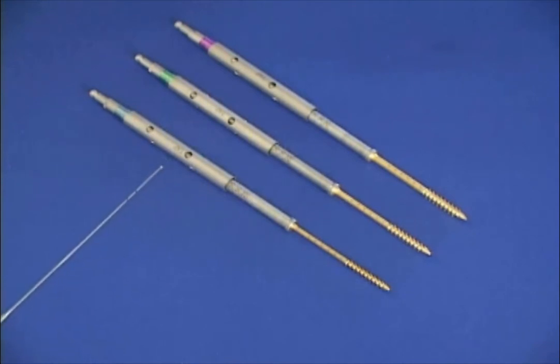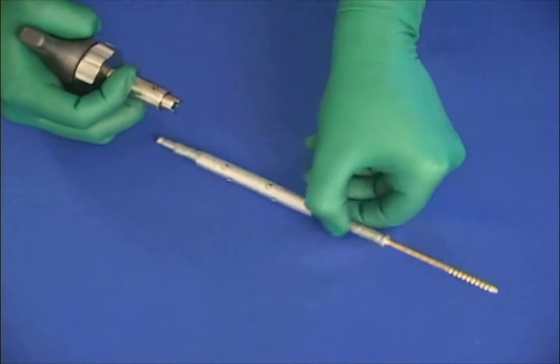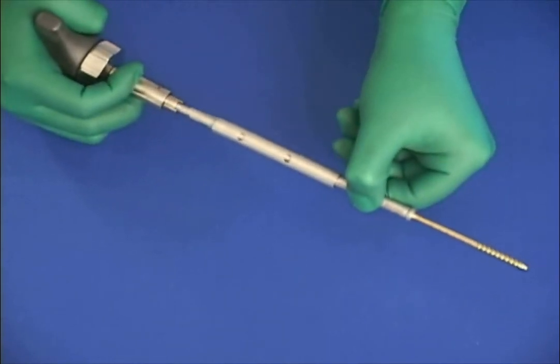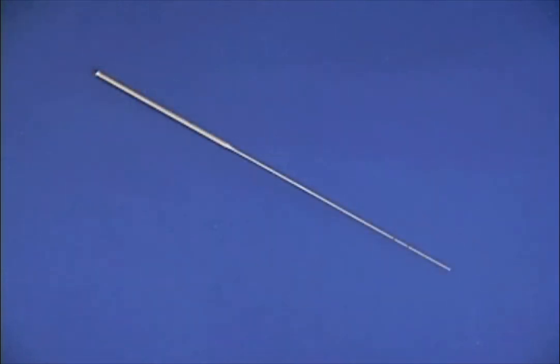A soft tissue sleeve is offered to cover the cutting surfaces of the instrument during initial insertion. Taps are offered for each screw diameter from 4.5 millimeters through 8.5 millimeters. Taps are loaded into and released from the ratcheting T-handle by pulling back on the Hudson fitting of the T-handle. A flexible sound is supplied to allow one to tactilely probe the pedicle after preparation.